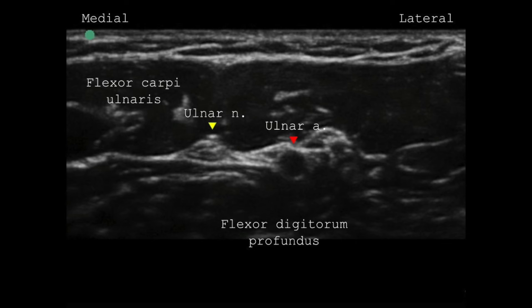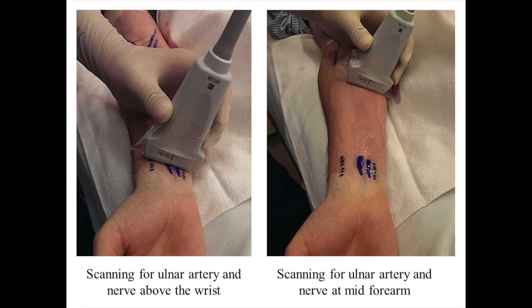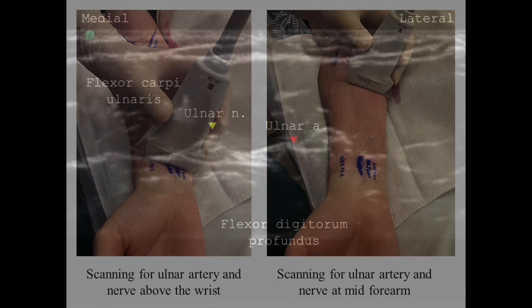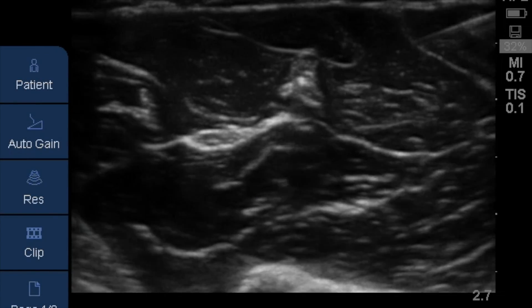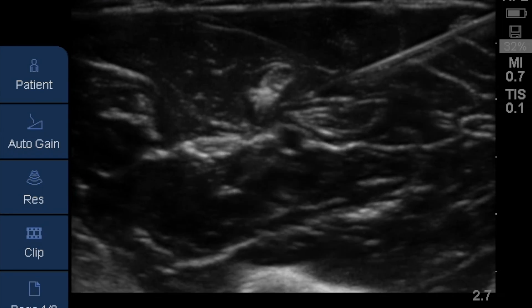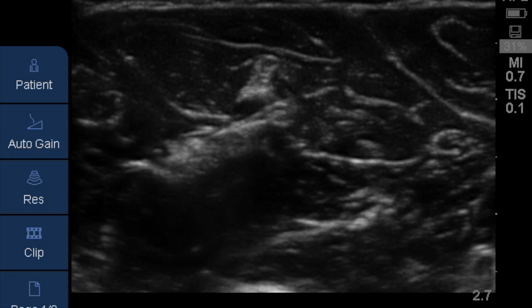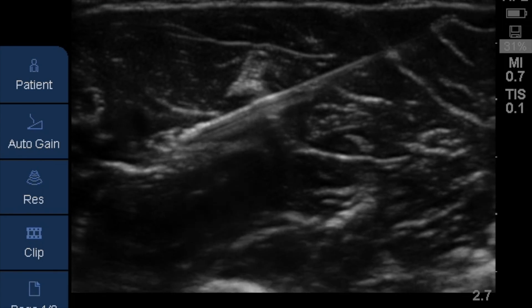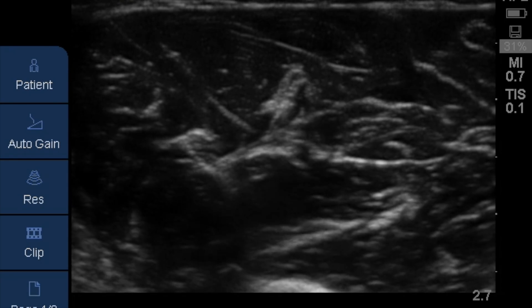This relationship is helpful in identifying the nerve. For a mid forearm level block of the ulnar nerve, the patient's arm is positioned supine. A linear transducer is placed just above the wrist on its medial aspect to identify the ulnar artery. Proximal scanning shows that the ulnar nerve is usually seen as an oval hyperechoic structure immediately medial to the ulnar artery. After raising a skin wheel using a local anesthetic, a 22-gauge, 50 mm short bevel block needle is introduced in plane or out of plane, aiming to enter the fascial plane next to the ulnar nerve. An injection of 5 mL of local anesthetic is made after negative aspiration to cover the nerve circumferentially.